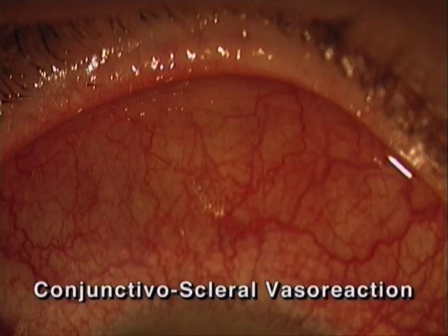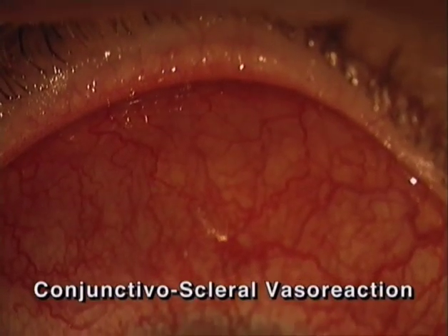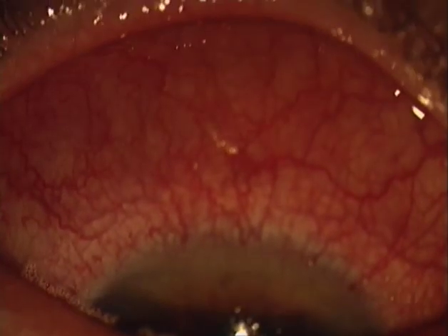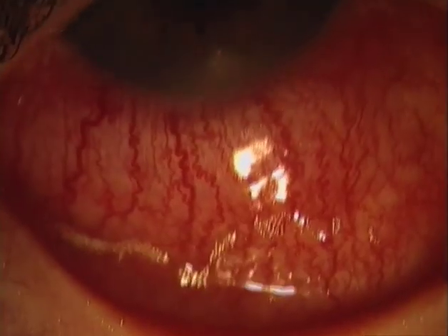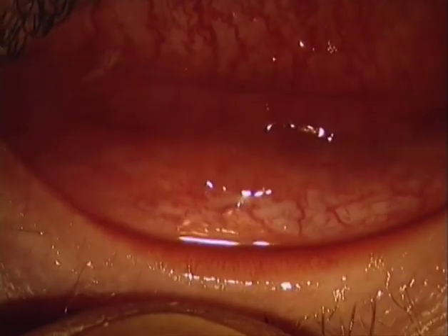Conjunctivo-scleral vasoreaction. In this next case, there is a combination of conjunctival and scleral vascular reactions, with strong involvement of the deep epibulbar vessels and severe disturbance of the limbal capillaries, as well as an irritation of the superficial vessels. The involvement of the lids, in contrast, is only moderate.